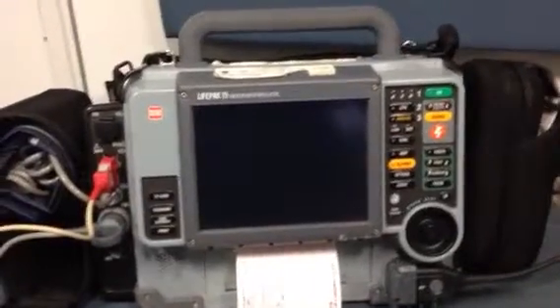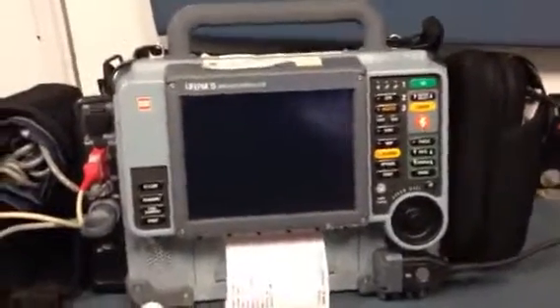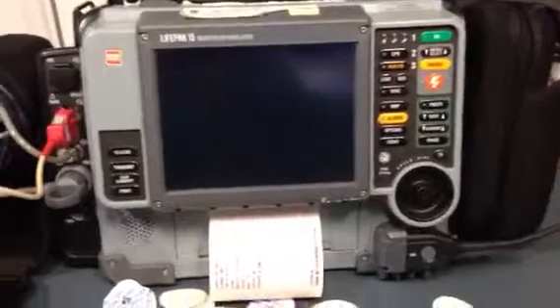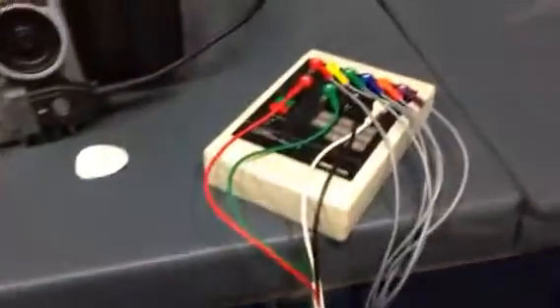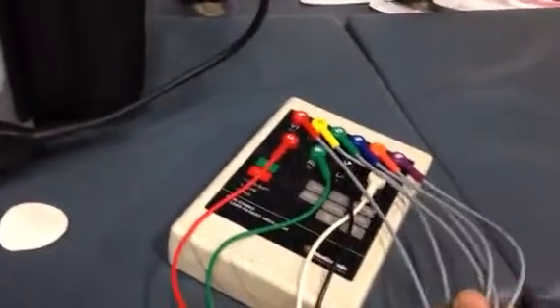In Module 6, we're going to investigate sinus bradycardia. Revisiting our earlier lesson on Life-Pak 15 and modules, you'll notice that we already have our 4 leads, our limb leads, attached to a cardiac rhythm generator, as well as our 12-lead hookup has already been placed.